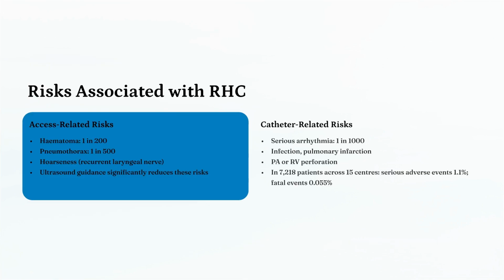Right heart catheterization carries some inherent risks. Access-related risks include hematoma and pneumothorax, which are significantly mitigated by the use of ultrasound guidance. Catheter-related risks, while rare, include arrhythmias, infection, or perforation. Serious adverse events are infrequent, occurring in roughly 1% of cases.